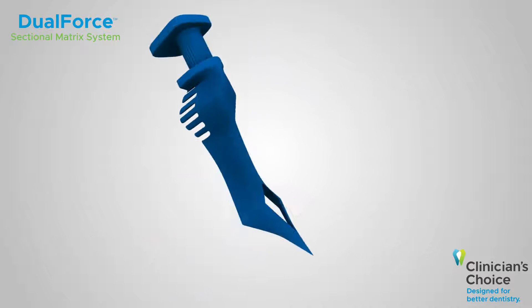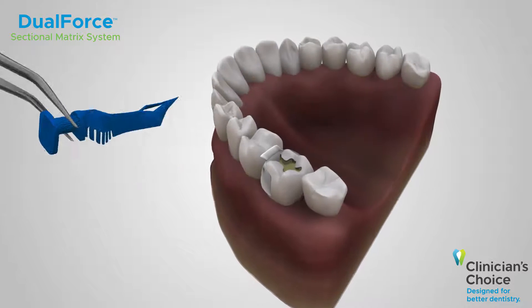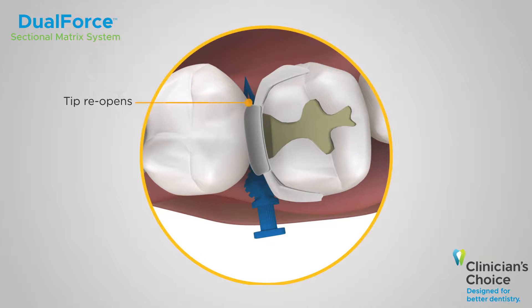Dual force active wedges can be easily placed with cotton pliers. To place a dual force active wedge, insert in a suture-like fashion and fully seat the wedge. You'll notice that the tip reopens once placed, regaining its full contour and sealing the matrix band.